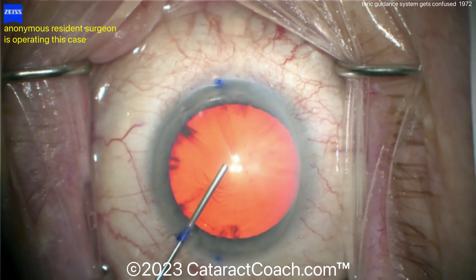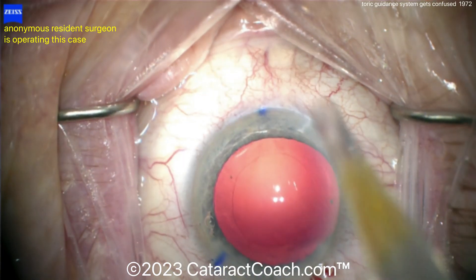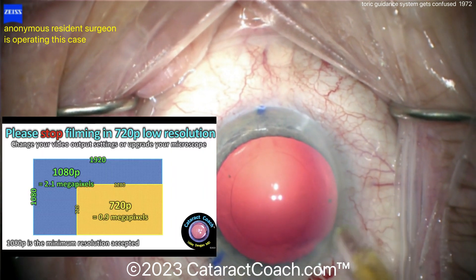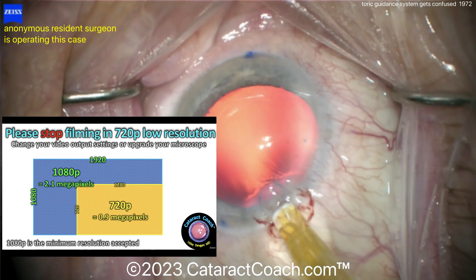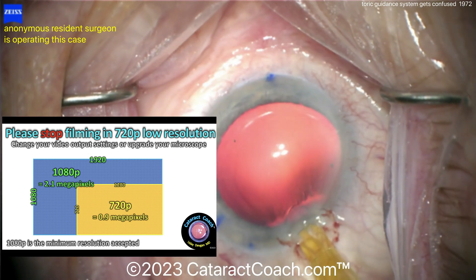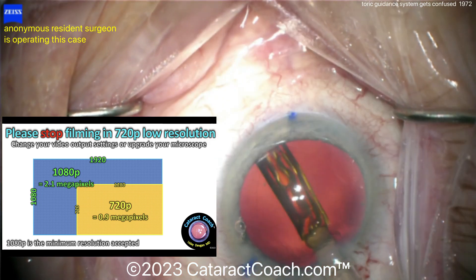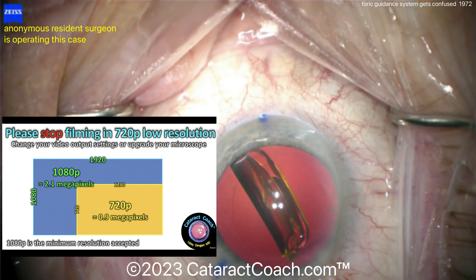You've got to take your judgment into account. Now, about Hi-Res: if you have a microscope that's putting out 720p, that is not high definition. That is 1280 by 720 pixels — less than 1 megapixel, specifically 0.9 megapixels.